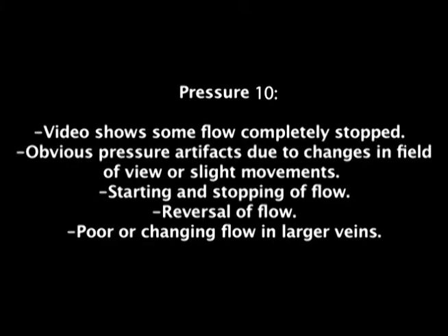Videos that were scored as a 10. Videos will get a score of 10 if they show some flow completely stopped, obvious pressure artifacts due to changes in field of view or slight movements, starting and stopping of flow, reversal of flow, or poor changing flow in the larger veins. Here are some examples of unacceptable pressure.